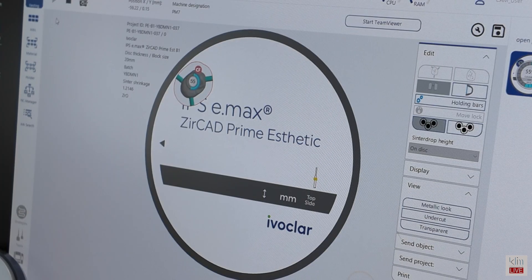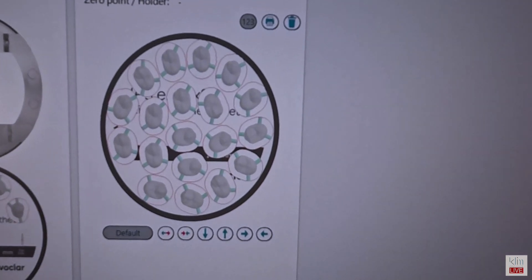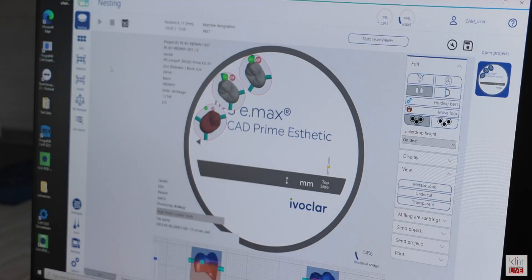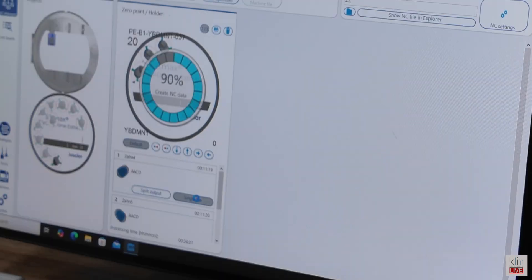Once we're done with this step, we can either start the mill process or add other projects. As you see here, we did quite a bit of milling for the class. To send off to the milling unit, click on NC manager on the side menu and that will open up the next step. Here we're going to use single file for all these restorations — that way we'll get multiple mills and can do this overnight, since we milled over 30. Or you have the split output option when you want to mill one restoration selectively at a time.